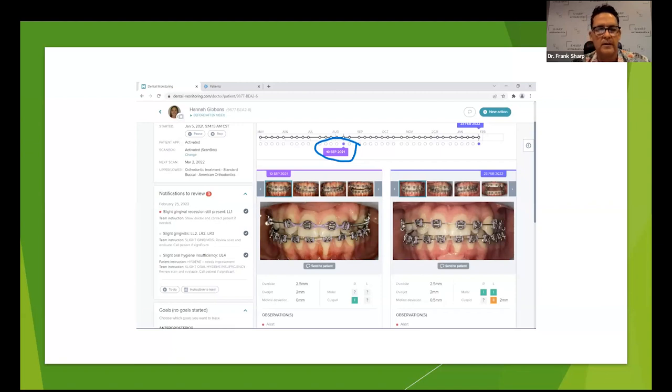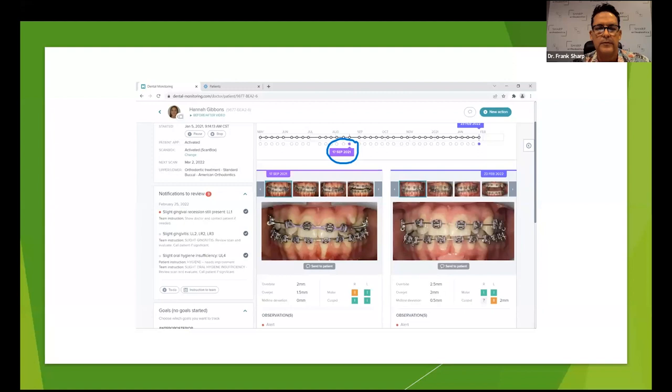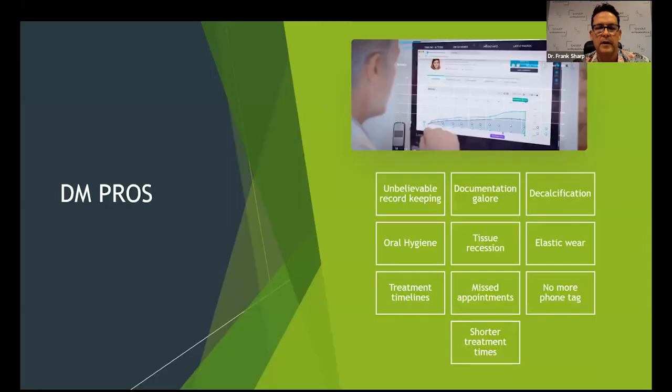She ended up having a lot of little extra frenums that you couldn't really see until you pulled extremely hard down on her lip. They're moving it in a lateral position and the tissue just started giving way. She wasn't scheduled to come in for another 10 weeks when we first saw her. We got her graft done, and that's where it was right before we did the graft. That's where it is afterwards. All that's documented. Unbelievable record keeping, documentation.